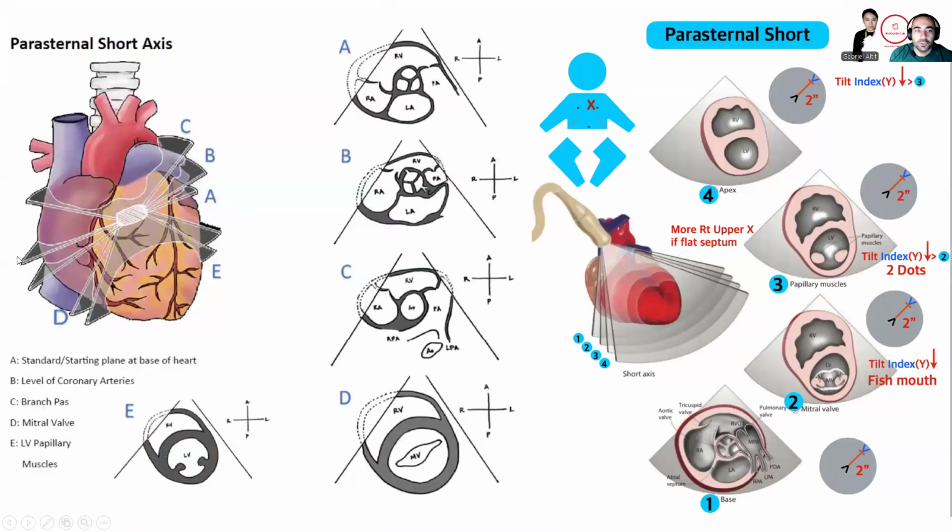So here you can see the probe, and you can see how you can cut by orienting your probe in different orientations. As you're getting closer to the neck, you're going to start seeing more of your C and B. So we can see that the C is more RV outflow tract, pulmonary valve, pulmonary artery with the right and left pulmonary artery, or B being your aortic valve that is trileaflet. Often we call it the Mercedes sign because it has this kind of Mercedes logo.